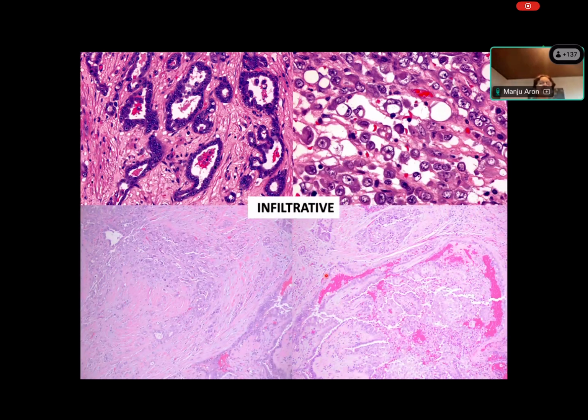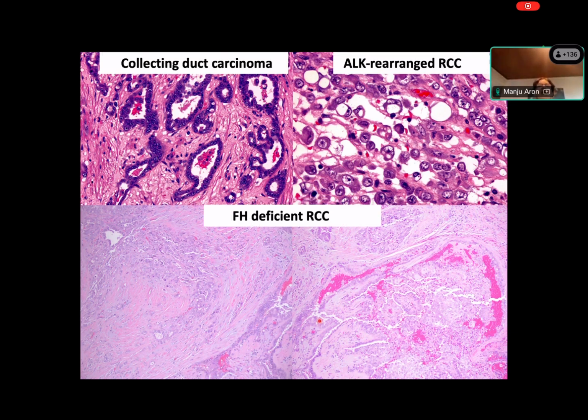Now here's an example of tumors which have this kind of infiltrative growth. Here you have these angulated gland-like structures or tubules which are infiltrating into this stroma, which is more sclerotic, hyalinized stroma. Here are cells which have very high-grade cytologic features, infiltrative, eccentric nuclei with some sickling of the RBCs in the background. Again, infiltrative growth pattern, more glandular, with some kind of papillary architecture, but again, it's all infiltrative, right? So these are examples of FH-deficient renal cell carcinoma, collecting duct carcinoma to your left, and ALK-rearranged renal cell carcinoma, which, as I mentioned to you, can be seen in a setting of hemoglobinopathy.